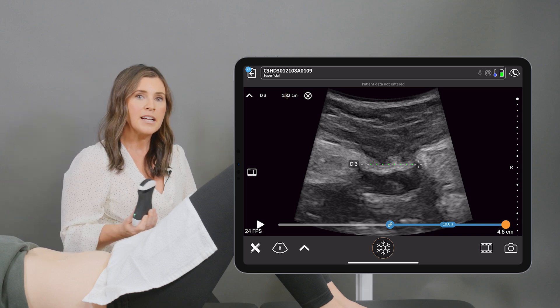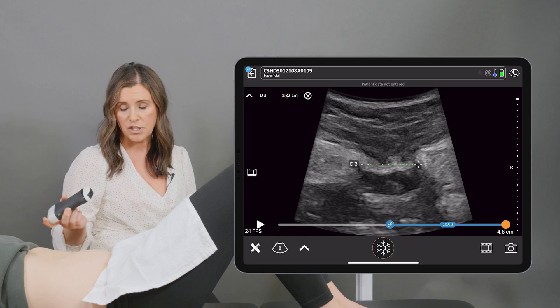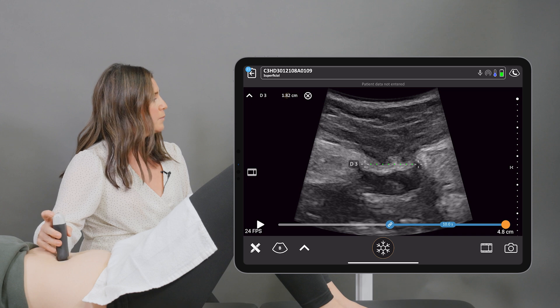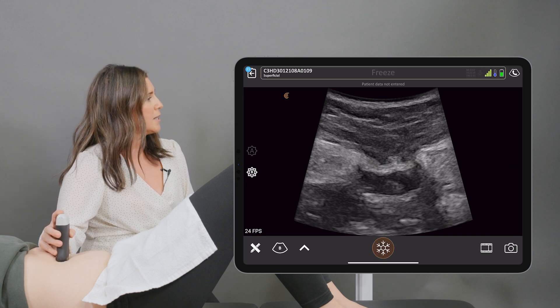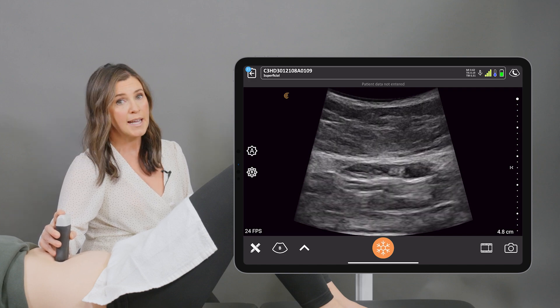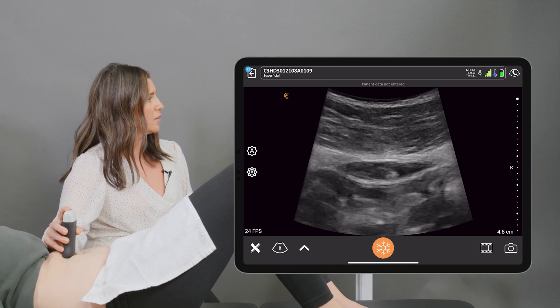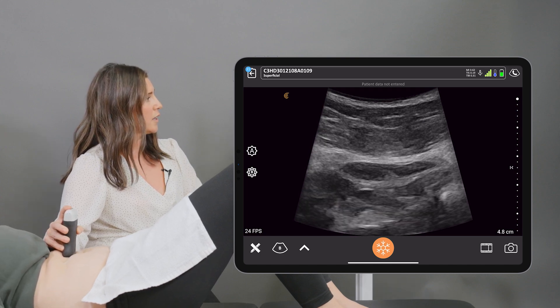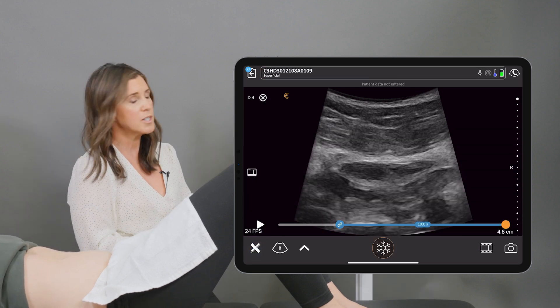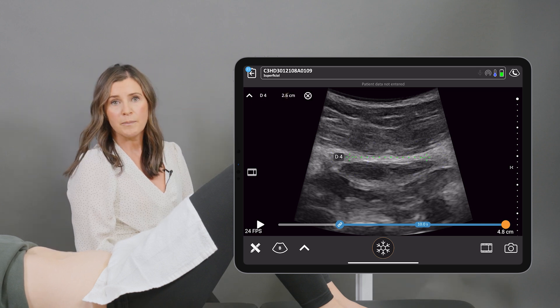We can also compare that to another activity where we pre-contract or cue the client to do a specific contraction. Placing the probe at that same spot, we're going to unfreeze the image. We're going to get the client to connect to their pelvic floor before they curl-up, and then get them to curl-up. Good. Then we're going to freeze and get them to relax back down, and again pull out our calipers and re-measure from one end to the other, getting that third measurement.